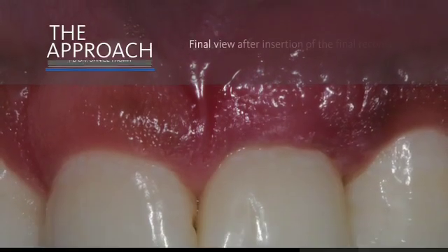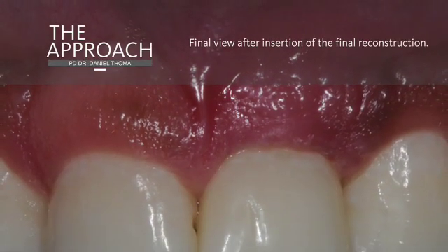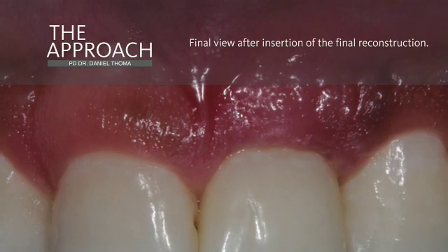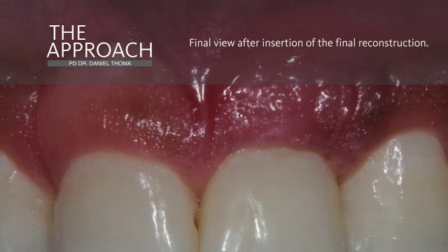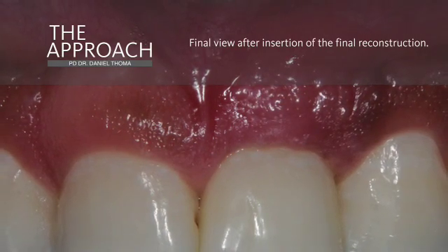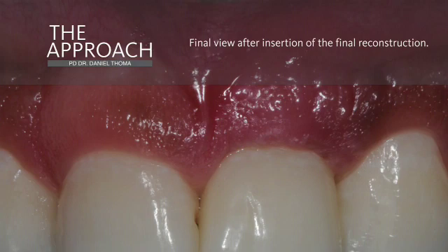Finally, a final impression is taken and the final implant-borne single-tooth reconstruction is inserted, made with a zirconia abutment and directly veneered ceramics.